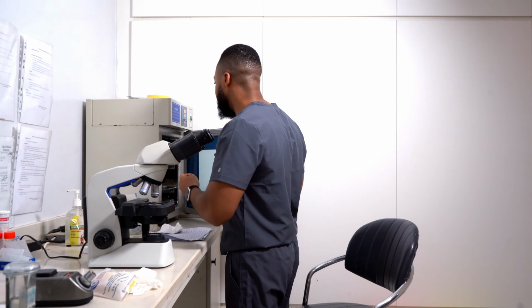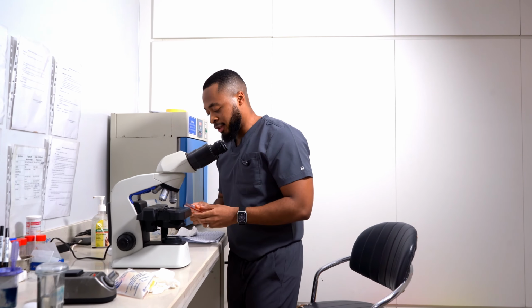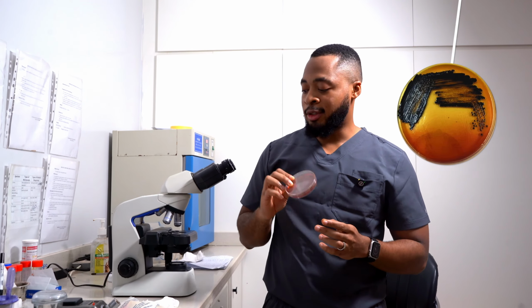So after 24 hours, we expect to see the salmonella that is causing the problem for you, and we remove it from the incubator. When we remove it, because this is a dummy sample, you won't see anything in this, we expect to see a growth on this plate. There will be a picture that will pop up now to show you what the salmonella will look like. We then perform biochemical tests on that to be sure that yes, this is a salmonella, before we now go to the next and final step.